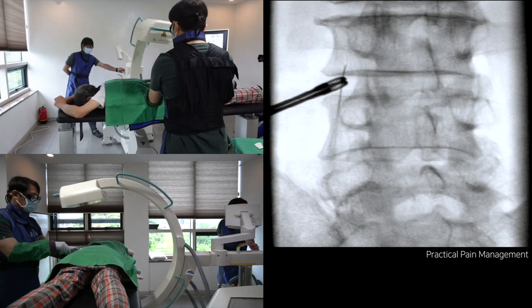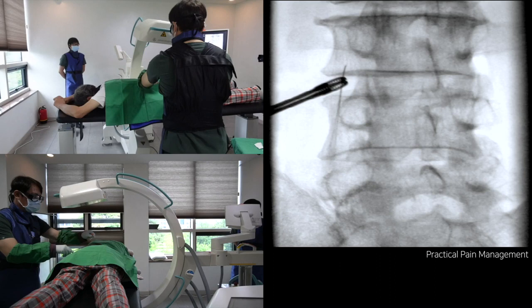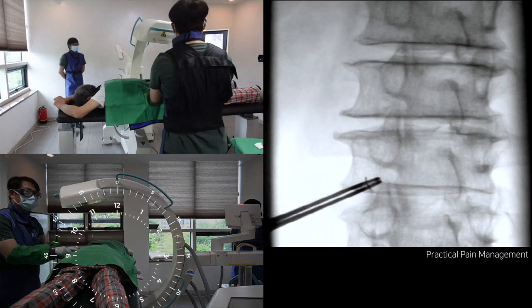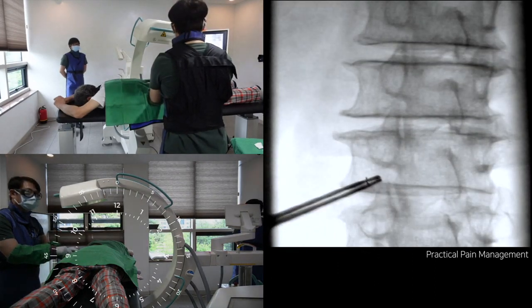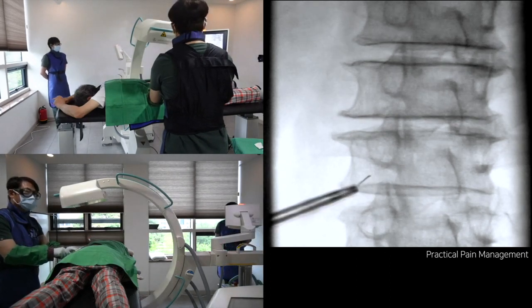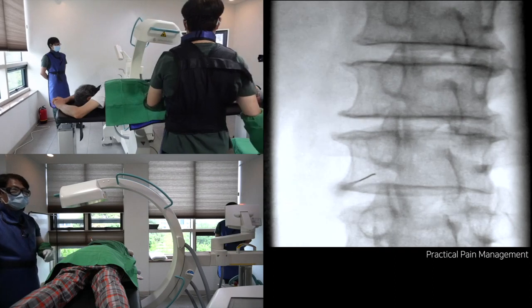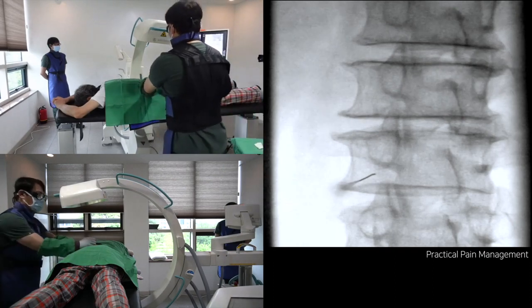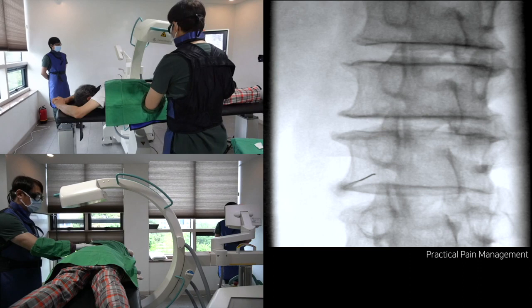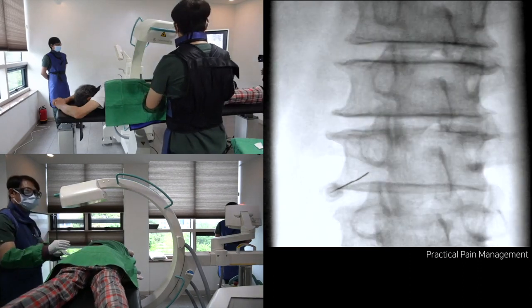It is a simple case of left transforaminal injection of L2-3 roots. I already tilt caudally about 8 degrees ipsilateral obliquely, so I don't need many degrees of rotation in the procedure of the upper lumbar spine. The inferior aspect of the 6 o'clock position is the target. The rigid muscle prevents easy access to the needle, so let the patient relax.